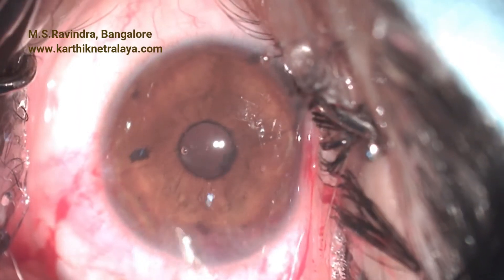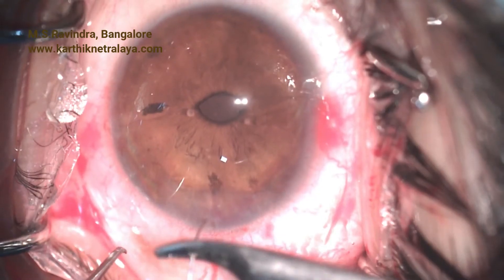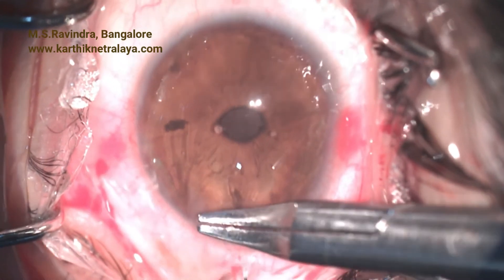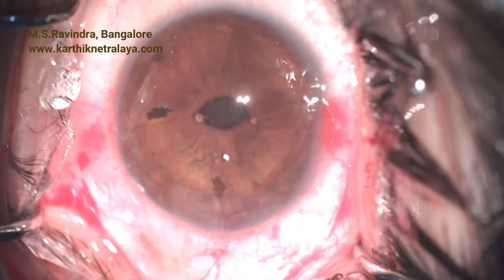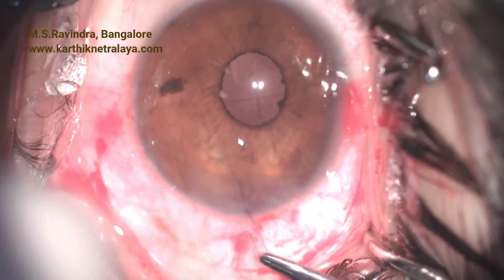Being a young person, I am putting one stitch, tightened just enough to maintain the integrity of the tunnel — it should not be tightened too much to cause astigmatism. The other eye was operated a week ago, and the patient has been extremely happy with the visual rehabilitation.